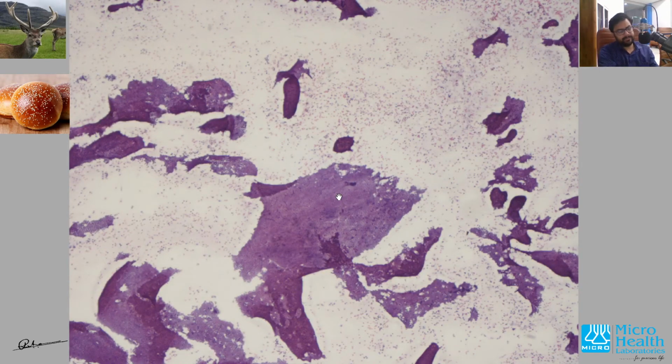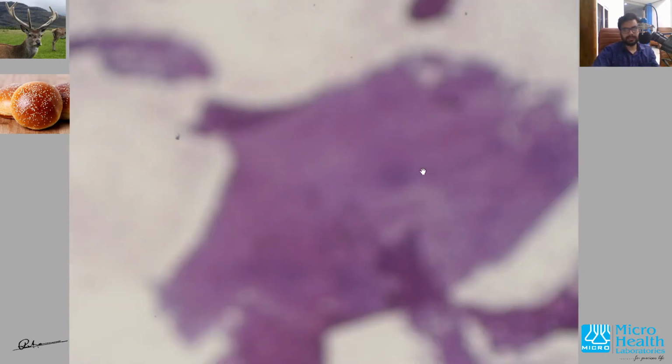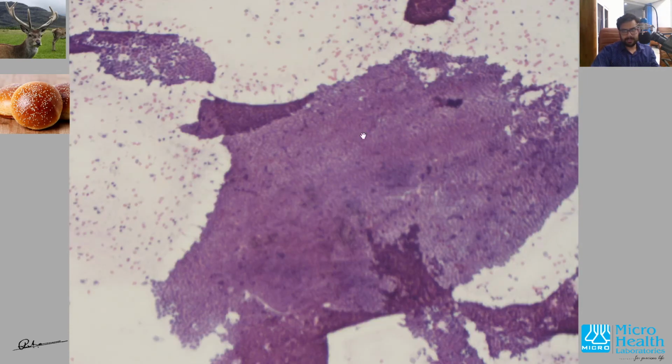Okay, so this is a sheet, like a kind of a sheety appearance. This is a sheet.